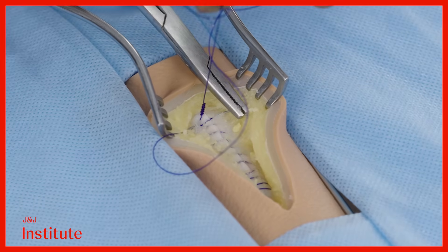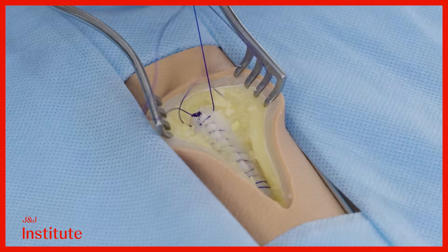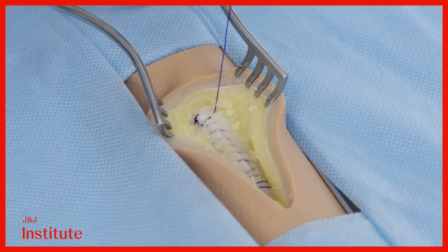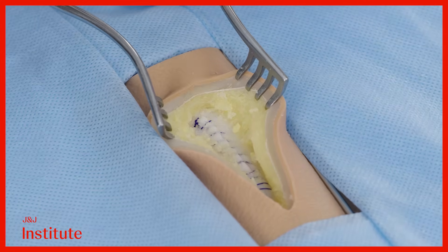Emerge obliquely a short distance away. Avoid taking a deep bite to prevent injury to the underlying viscera. When you have pulled the entire thing through, the Aberdeen knot will be buried deep underneath and you can cut the suture flush with the fascia for a neat finish.